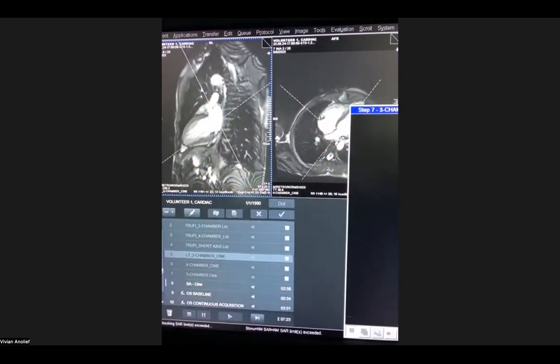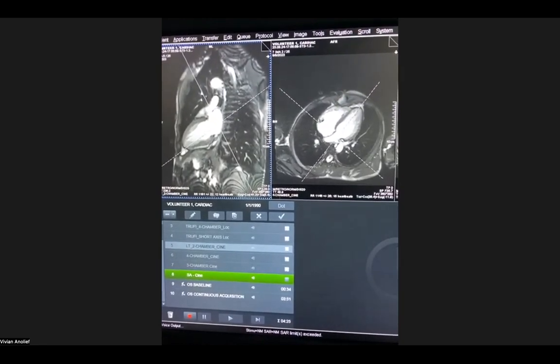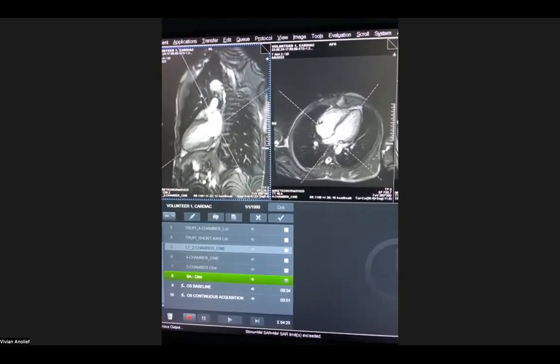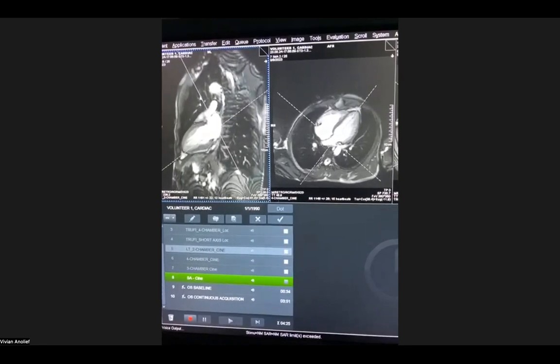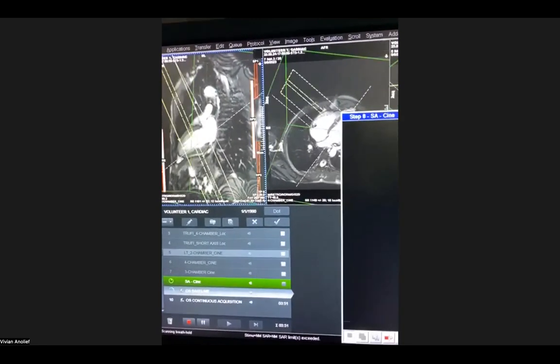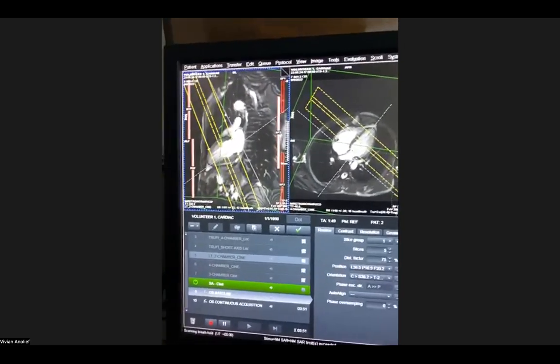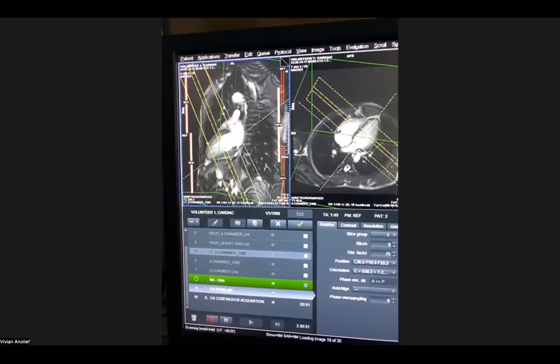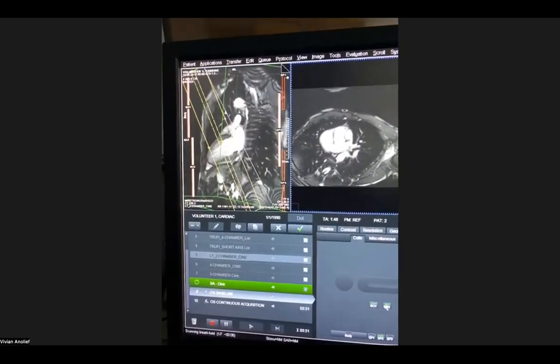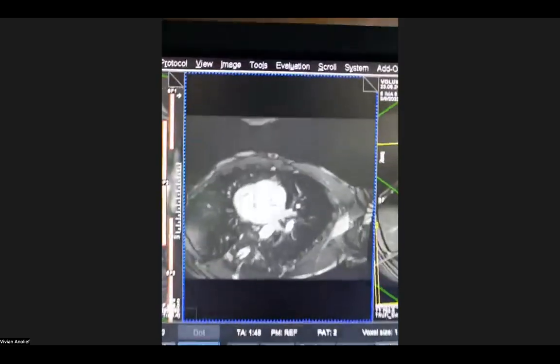So that's why I'm having them check, because they have 6 coils. They have an inherently low SNR here. So we try to find ways to increase the SNR, but often those have the impact of increasing scan time. With cardiac, you always have breath holds. You don't want to make the breath hold time atrocious, because then patients can't do it, and then you get into artifacts coming from motion. So it's always a balance between these different parameters.